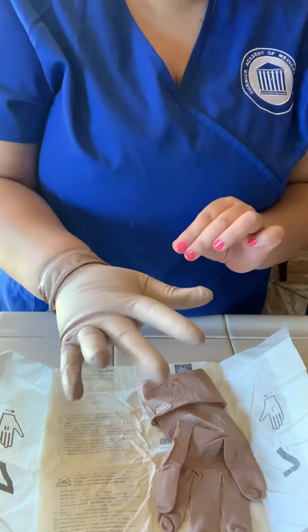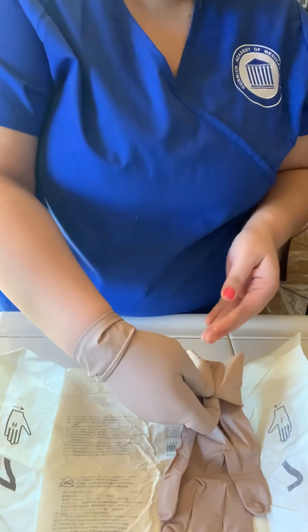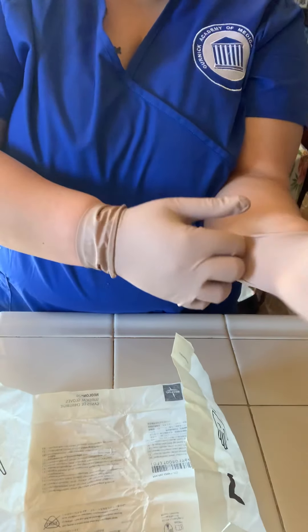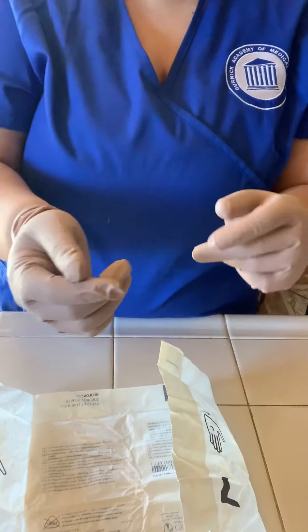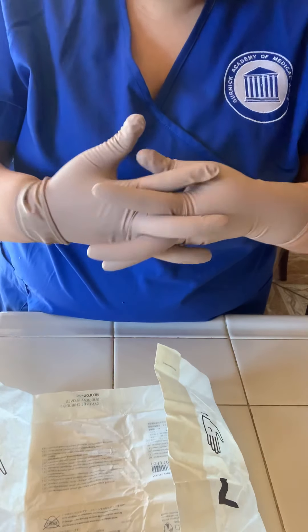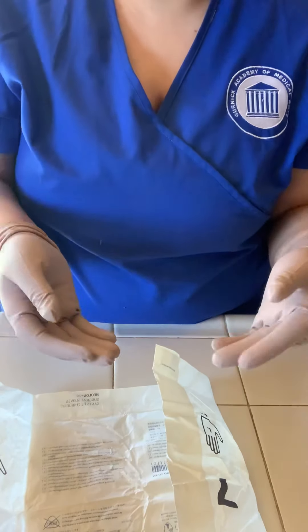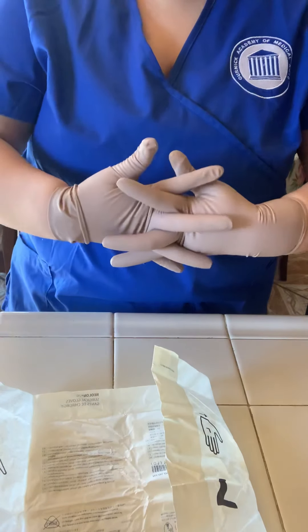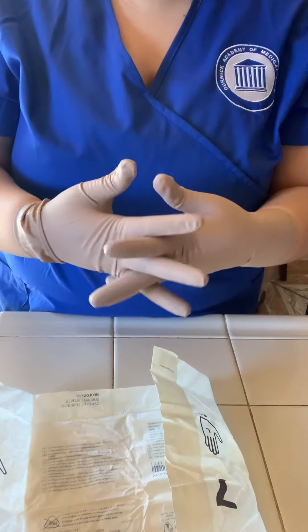Now since this hand is already covered with the glove, you are able to touch the outside of it to help this hand get the glove on now, just like this. Making sure that you're not cross-contaminating anything. Once you have done this, you can go ahead and fix your fingers if they're not in the correct place, only because now you have both hands with the sterile gloves. You want to do this at the height of your waist, just to make sure that they're on right and nicely.